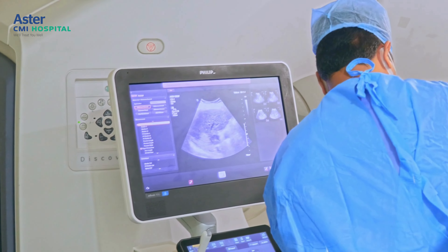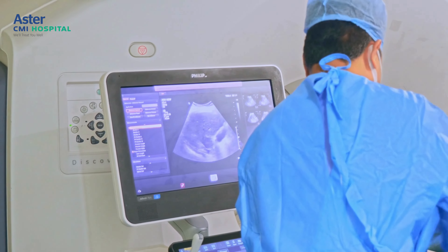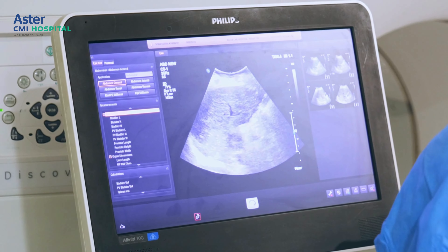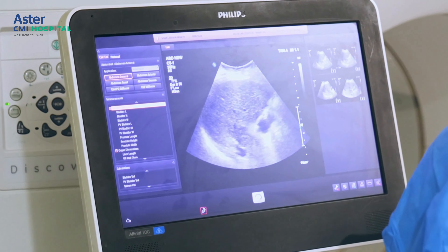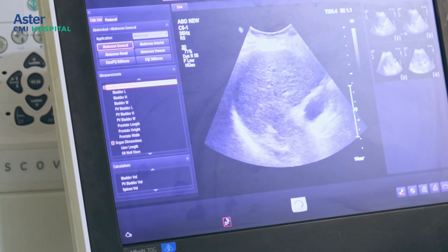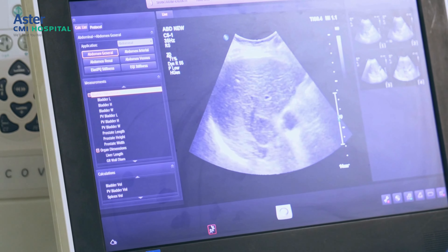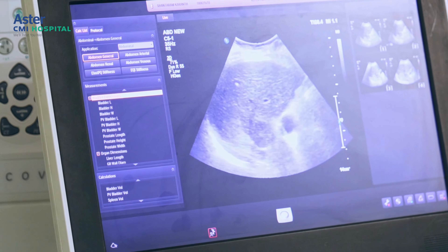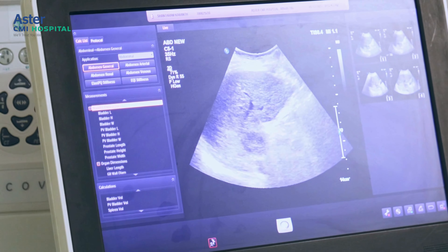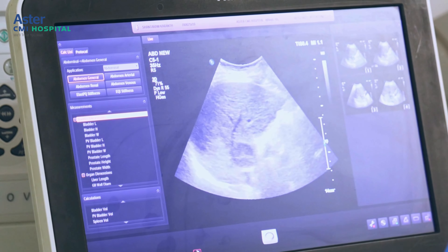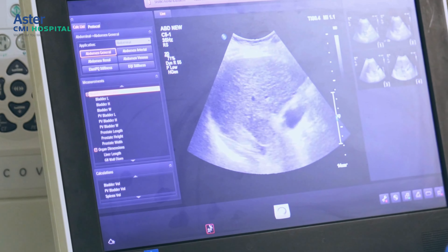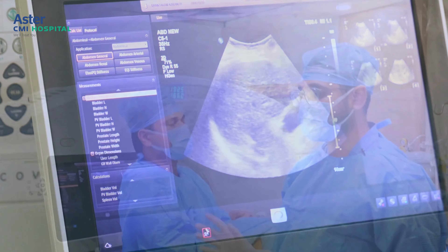We generally like to do ablation procedures under sedation with our anesthesia team backup. We want to start deep sedation once we place the needle because we do not want too much respiratory motion. Right now we are giving local anesthesia up till the liver capsule so that the patient is comfortable when we are placing the needle. You can see the entire needle track going up till the capsule. We want to infiltrate local anesthesia up to the capsule so the patient is pain-free on needle insertion.